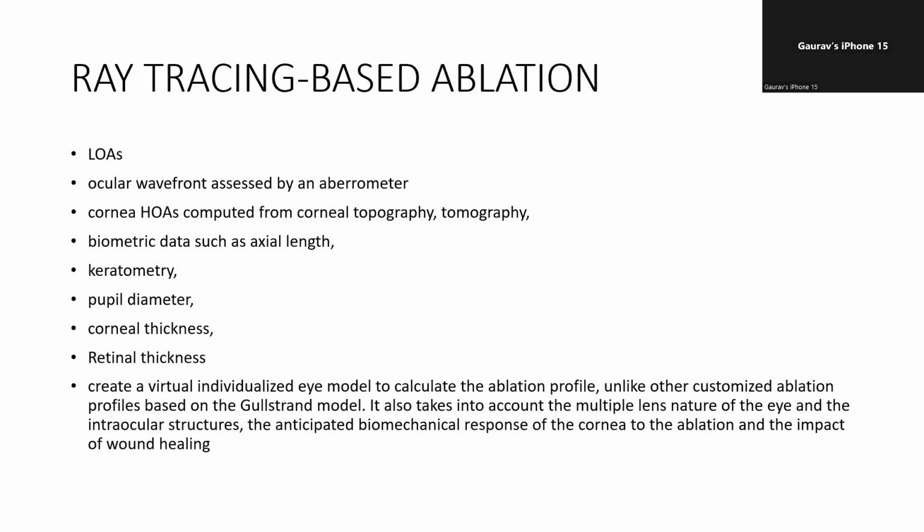All the previous treatment patterns were based on the Gullstrand model of the eye, but ray tracing based ablation generates an individualized eye model. It also takes into account the multiple lens nature of the eye and the intraocular structures, the anticipated biomechanical response of the cornea to the ablation, and the impact of wound healing.